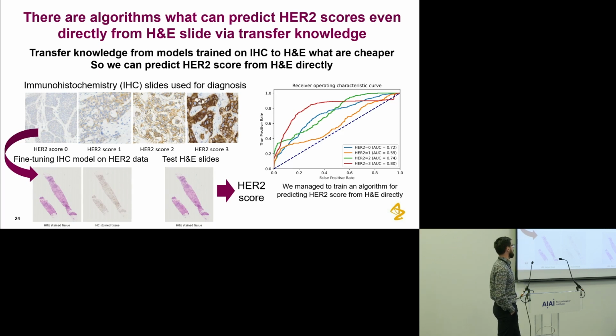Yeah, I think it's a very challenging problem in general, because there are so many parameters, right? There are demographics, and every human is unique, every cancer is unique. And then on top of that, tissue preparation. So usually we can take one parameter and try to control all the other parameters. For example, the scanner: we have a data set, we scan it with one scanner, another scanner, and then we can explore this variability, or tissue thickness. I think for demographics, it's much more complicated, right?